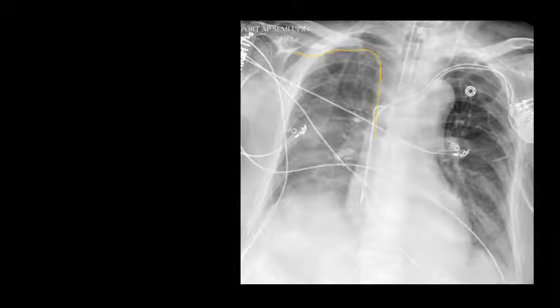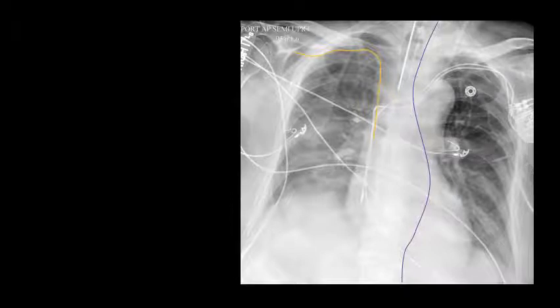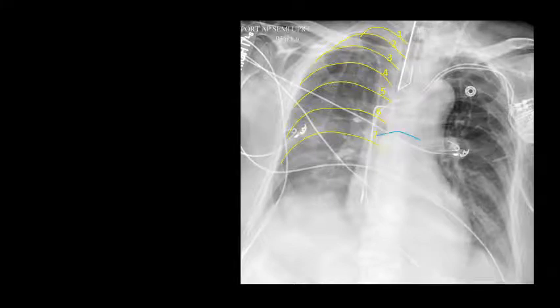Here is a slightly more difficult example, predominantly because of the overlapping lines and tubes within the screen. We see a subclavian catheter, a nasogastric tube, and overlying pacemaker defibrillator leads, but our endotracheal tube is delineated by a thick white line. We cannot see the carina due to technique, but by counting ribs down to the 6th or 7th, we know the carina should be approximately between T5–T6 and T6–T7. This is an appropriate position, and we can also see the endotracheal balloon is below the vocal folds.